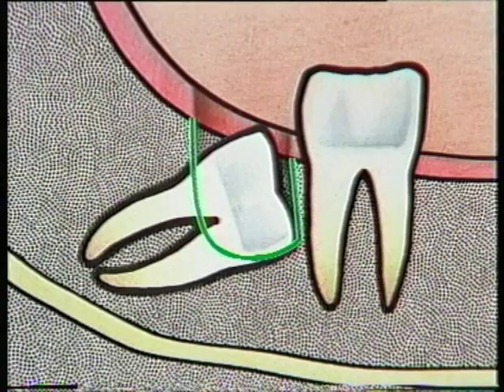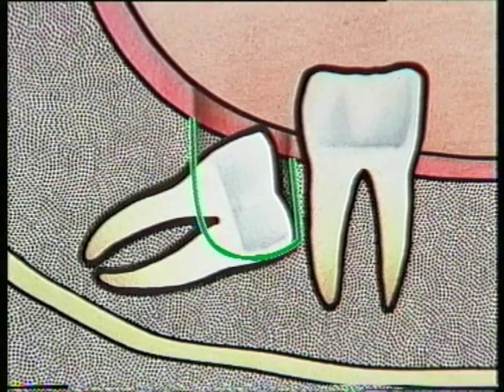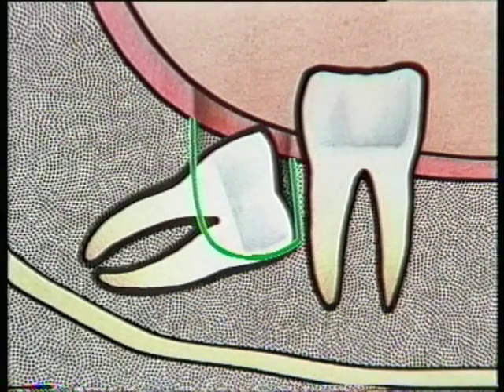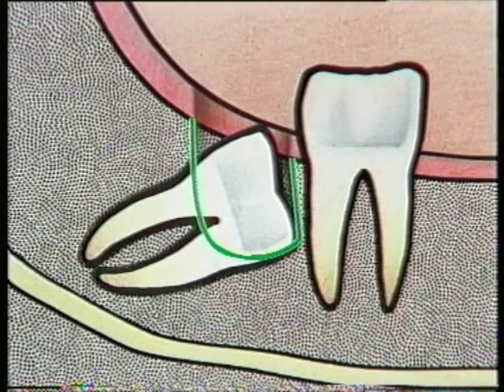The diagram shows the area to be removed for exposure of the crown, for sectioning, and for the point of application of the elevator for its removal. Also, for the exposure of the roots distal to the vertical section, so that they may be sectioned and allow for the points of application of the elevator for their removal. At this stage, you can see now how large a surgical cavity you will have created, and hence with foresight can design your mucoperiosteal flap with this in mind.